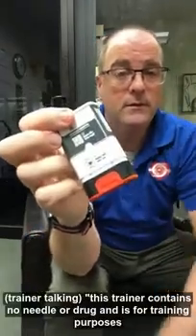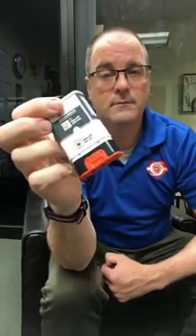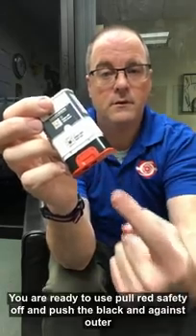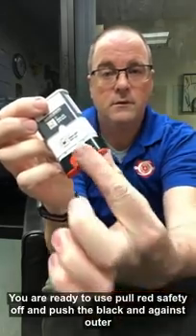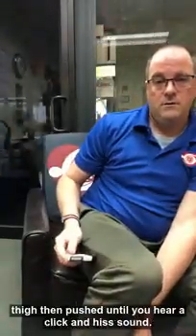This trainer contains no needle or drug and is for training purposes only. Do not use this trainer during an allergic emergency. If you are ready to use, pull red safety guard. Place black end against outer thigh. Then push firmly until you hear a click and hiss sound. And 2, 1. Training complete.